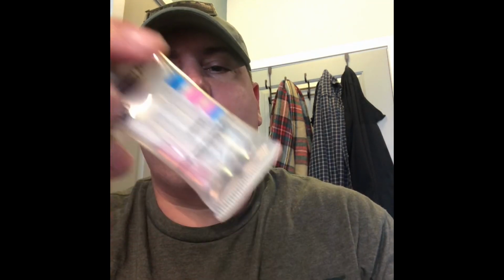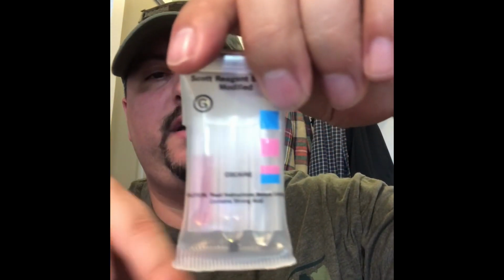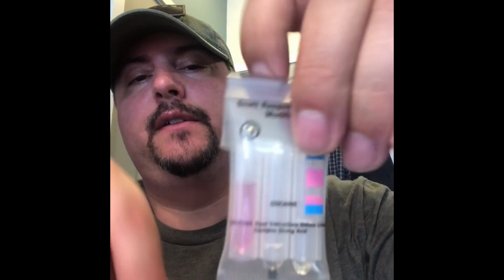So this is the crack cocaine test kit. We're breaking left to right. The first one we're going to break is this one. What color is that? It's pink. Okay. So we're going to break that one first. Is anything going to happen? Pink liquid is introduced into the kit, so it's going to turn pink, obviously, right? Oh, now it's going to happen. It turns blue.